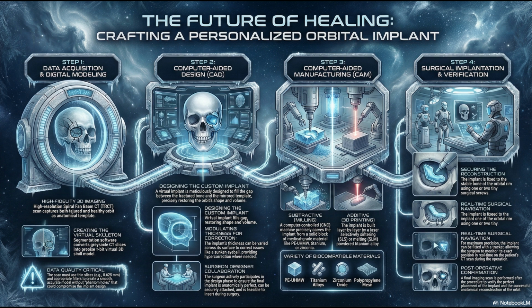If your initial scan can't do that, the designer is flying blind. They can't answer the key questions. Is a muscle trapped? How much volume do we actually need to add? If you can't see the soft tissues, the whole design process is essentially paralyzed before it even starts.